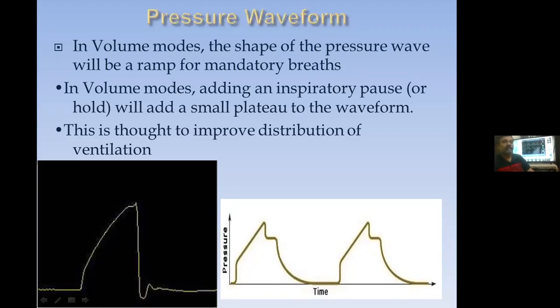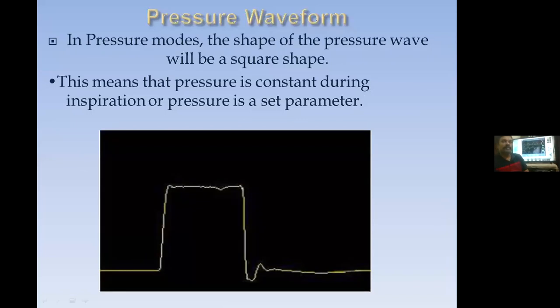So if this kind of thing is showing, there will be a chance of improving the ventilation. Okay, so like that we can find out the changes in the waveform. We are able to identify the patient's response.